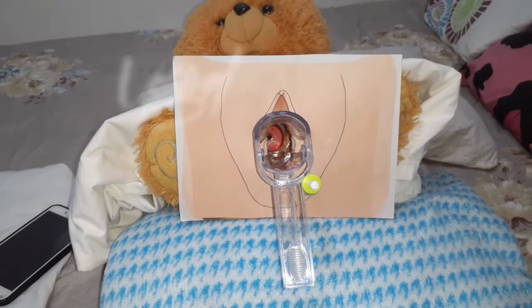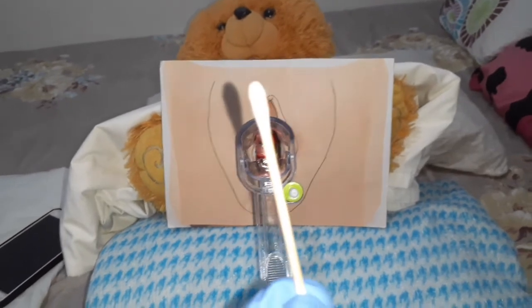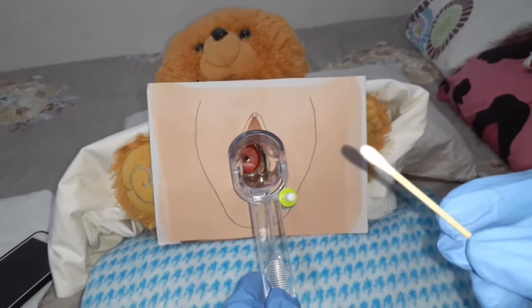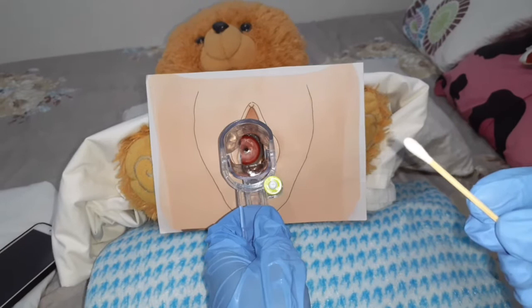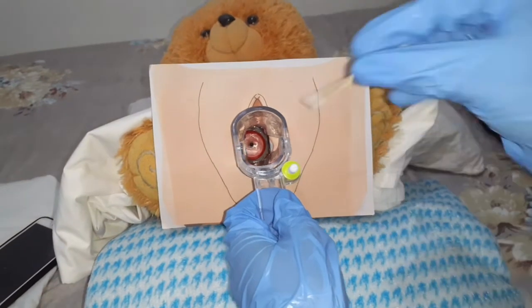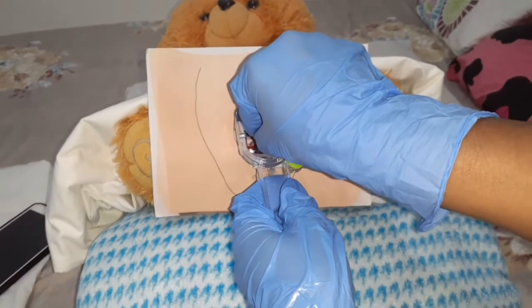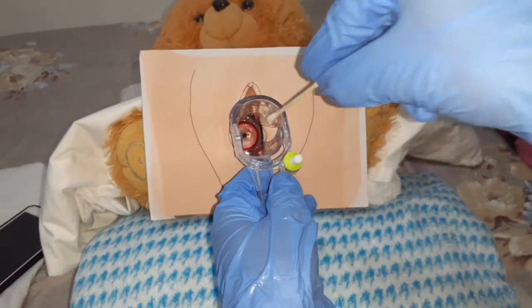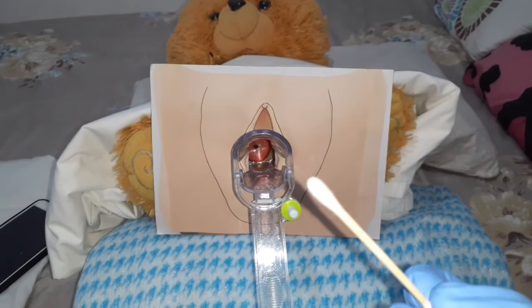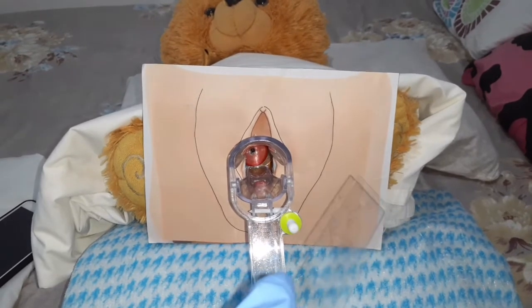For the last specimen, the vaginal pool specimen, we are using a sterile cotton tip applicator. Then, insert this through the speculum and roll gently on the posterior fornix just below the cervix, which is also known as the vaginal pool, which is on that part. Then roll it gently. Then remove without touching the side of the vagina. Then again, smear it onto the third glass slide, making it as thin as possible. Then spray with fixative.